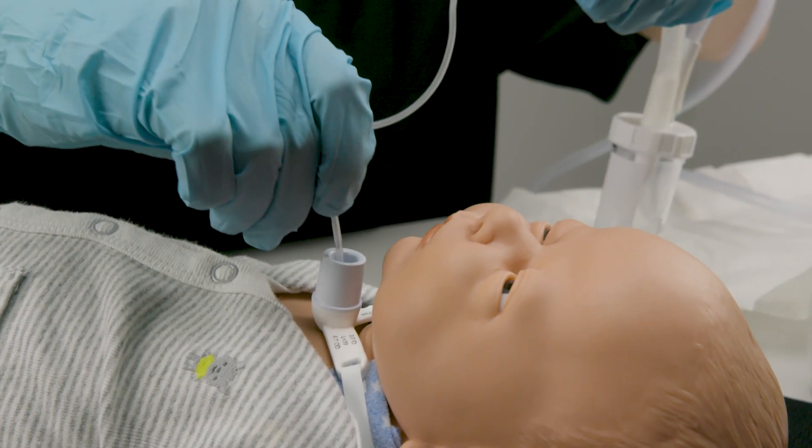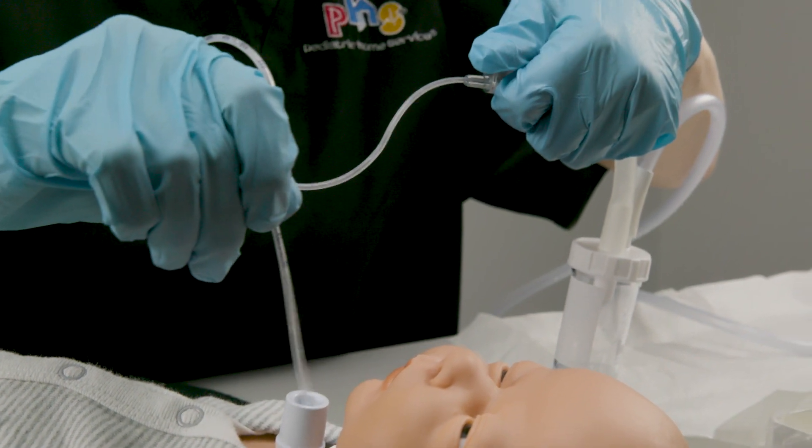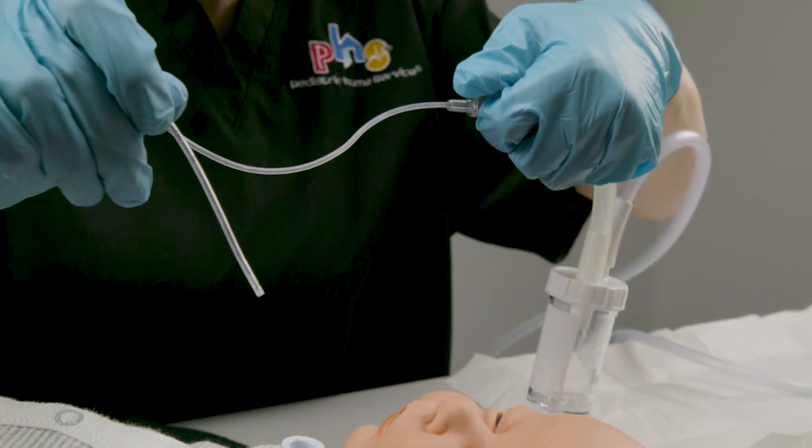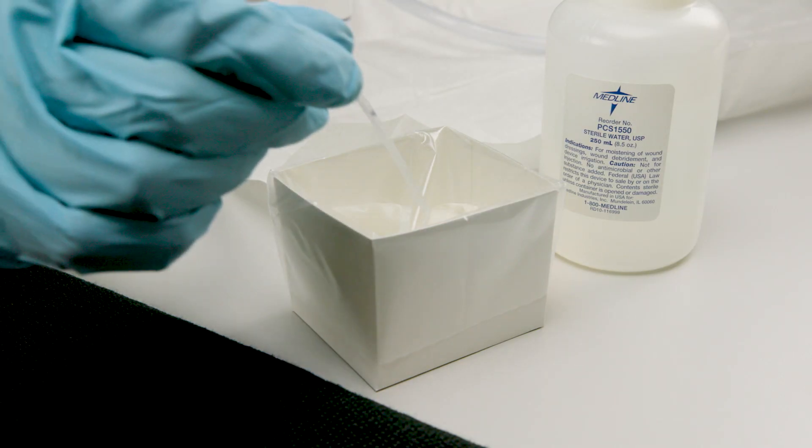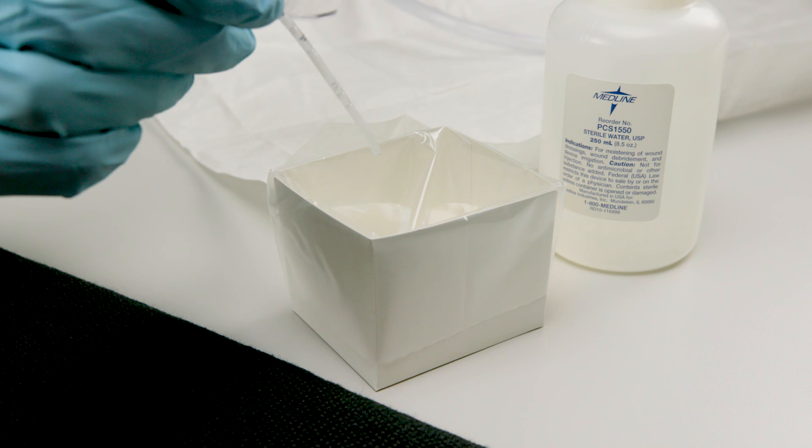When possible, collect the sample using only one pass with the suction catheter into and out of the trach tube. Use a small amount of sterile water to flush the sample into the trap only if needed.